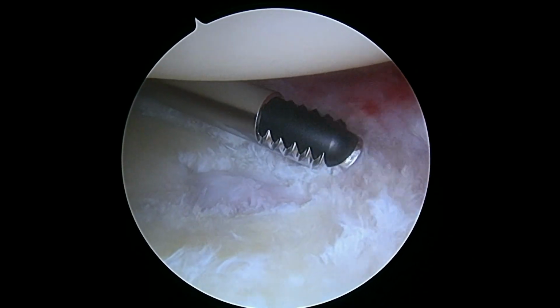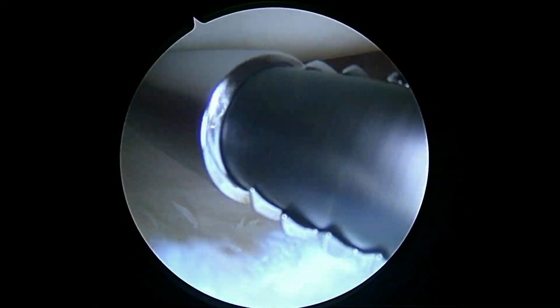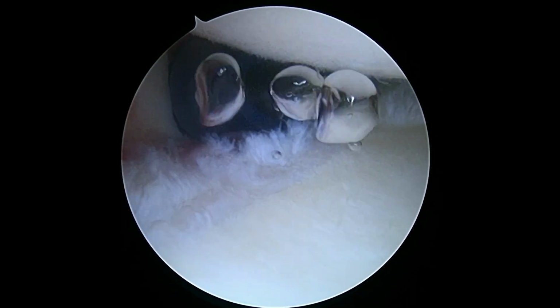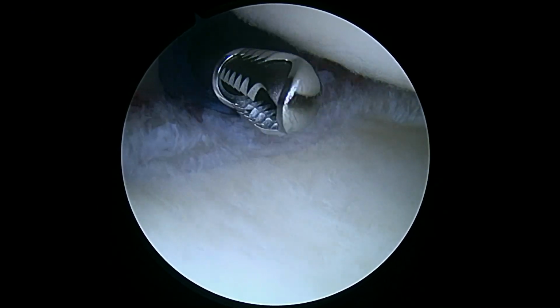But this is why we do a lot of our regenerative medicine injections in the office too, to prevent this from getting worse, and so you don't need to come back to the operating room for a shoulder replacement down the road. But okay, that looks a lot better than when we started. So now we'll get to work on the biceps.